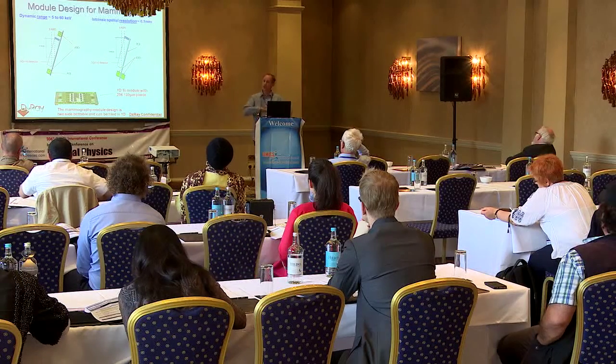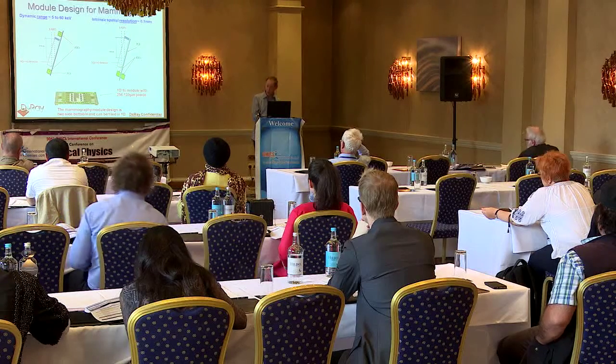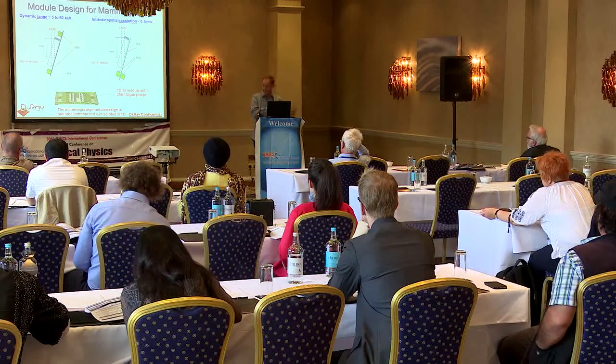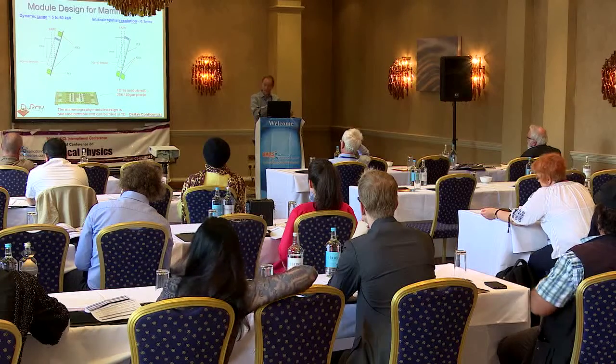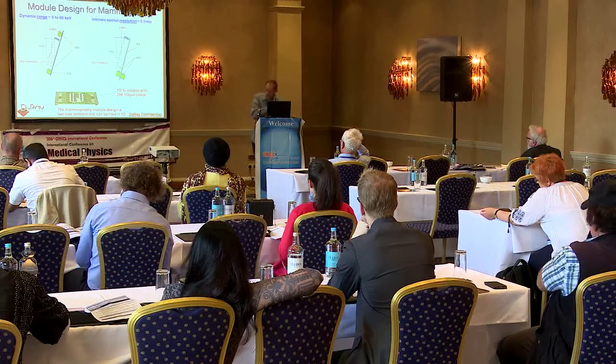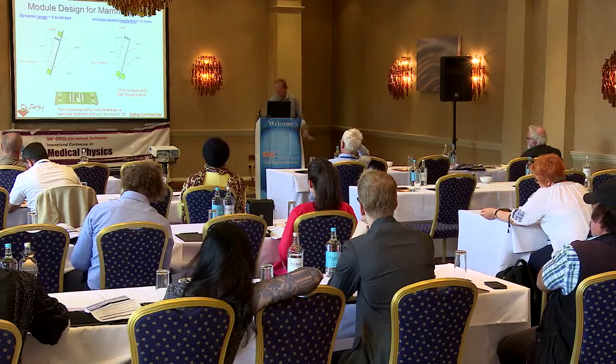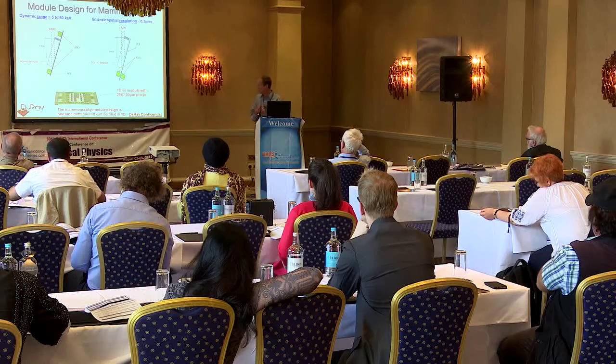And when the dose is low, the dark noise that occurs from conventional detectors is a significant detriment to image quality. So the photon counting method can eliminate that dark noise in the image. It can allow us to push the tube currents even lower and still obtain a good quality image.